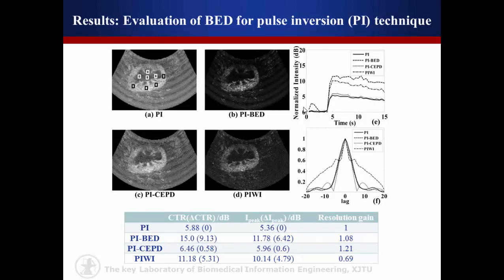Finally, BED for pulse inversion technique was studied. From the results, we can see that the increase in CTR of PIBED was much higher than that of CEPD, and was even higher than PIWI.